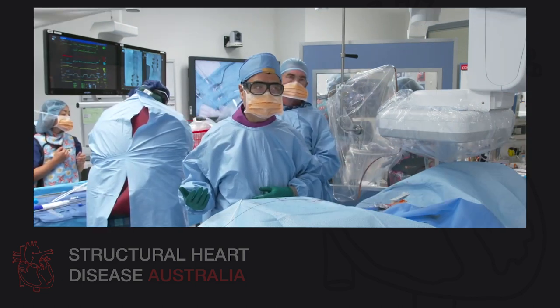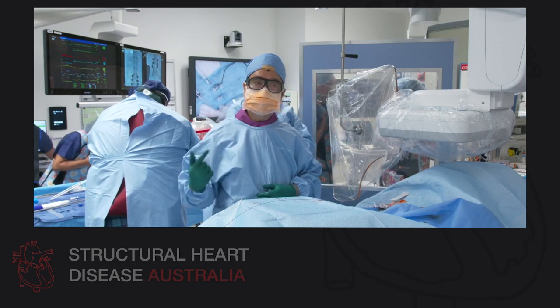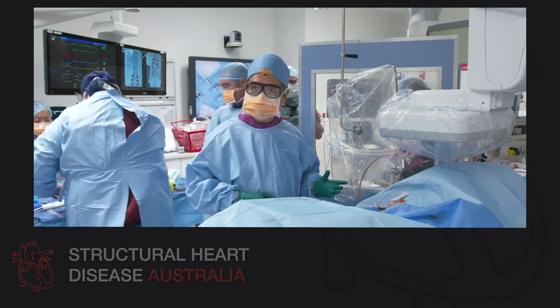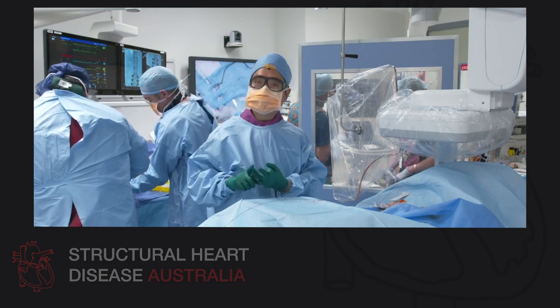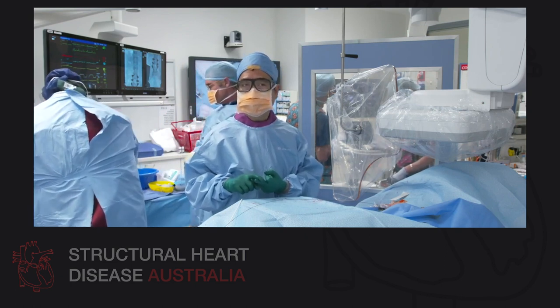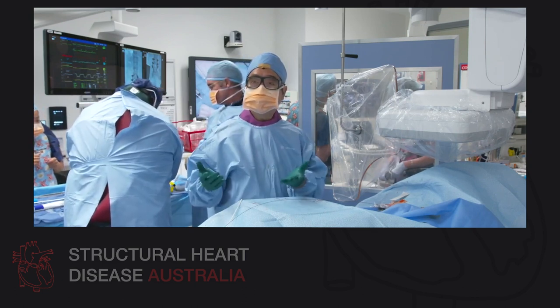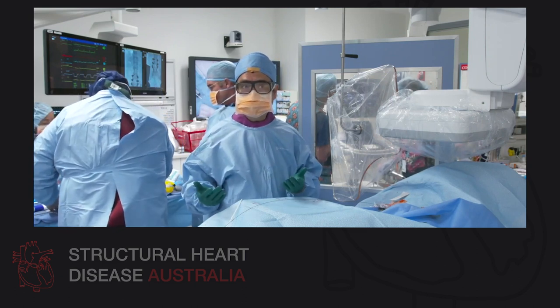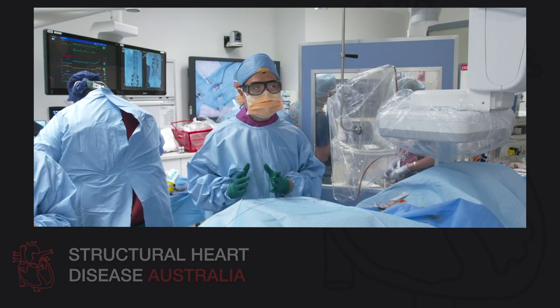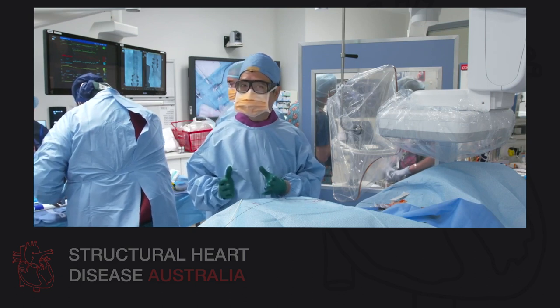The steps of the mitral clip procedure, or percutaneous edge-to-edge mitral valve repair, involve firstly a transseptal puncture. The second step will be for us then to introduce a steerable guiding catheter. And after that, we will introduce the clip delivery system. The clip delivery system contains the mitral clip, and that will be introduced through the steerable guide into the left atrium. Once we have the clip delivery system within the left atrium, we will then conduct the procedure of edge-to-edge repair with the mitral clip. So these are the key steps to deploying the mitral clip. Once the mitral clip device is in, we will then check and verify the adequacy of the grasp and review whether any additional devices are necessary.